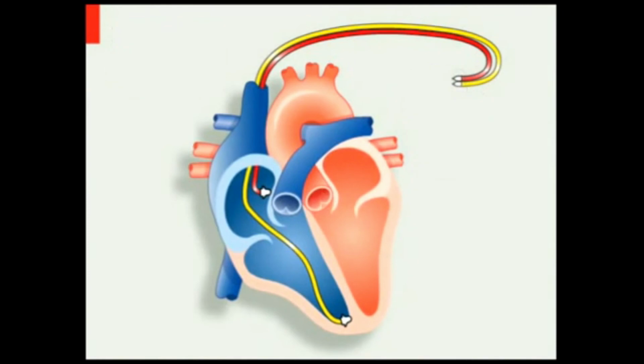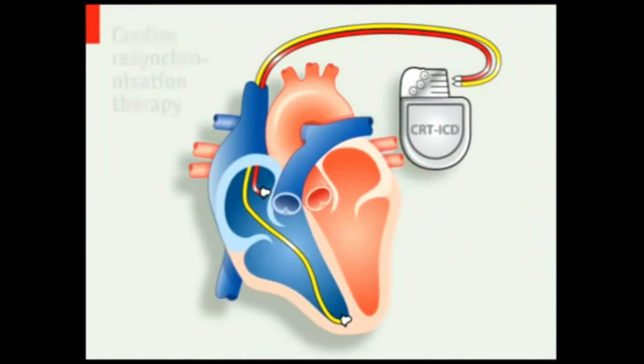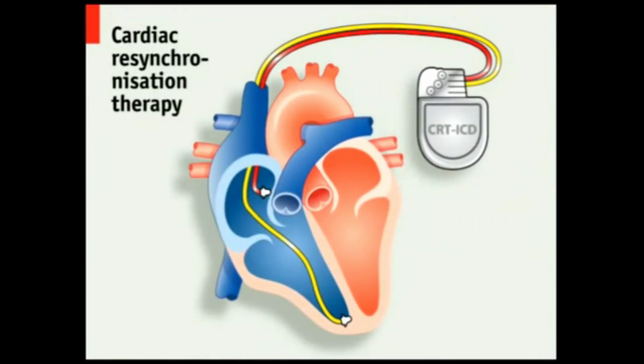For some critical heart conditions, we might need a CRT, which is cardiac resynchronization therapy. This uses a third lead inserted into the left ventricle to resynchronize the left ventricle whenever necessary.